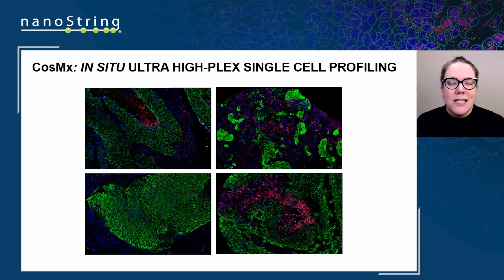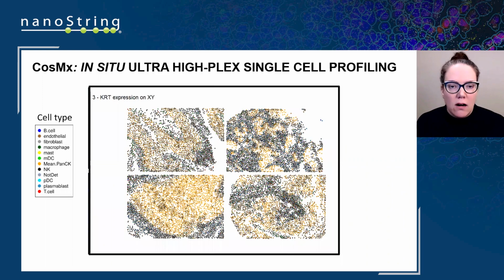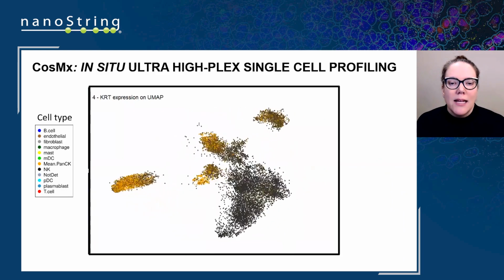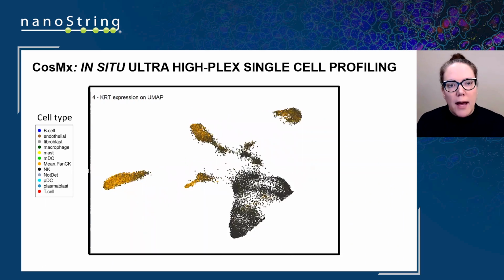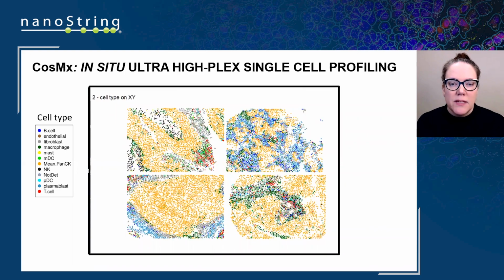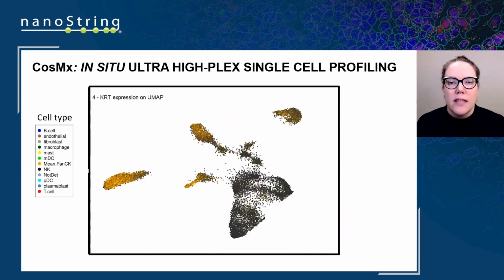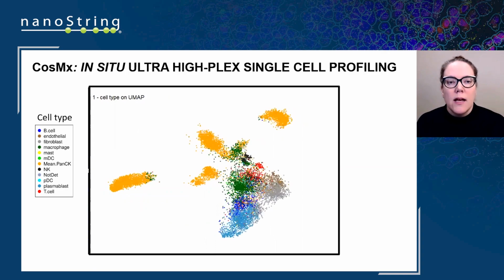So what we did, and these are select cores from the TMA of that large triple negative cohort, is we applied CosMx, and here you're seeing a very compelling animation of how you can map the UMAP back into the spatial context. We'll see it again here from the very beginning. So you get the UMAP with the big yellow nests of tumor, and then the other colors representing specific immune cells, and then you see them map specifically back to those areas in the cores. We superimpose keratin to keep the pathologist, myself, happy that things are typing as we would expect them to do. And then we get the confidence that not only is the single cell RNA-based typing working, but that the mapping is working.